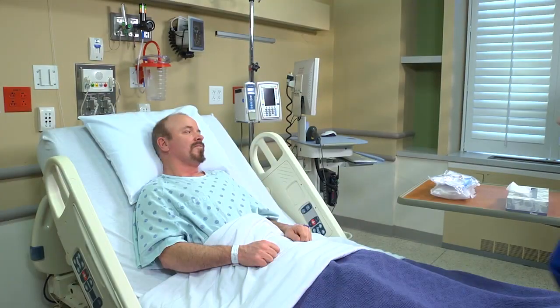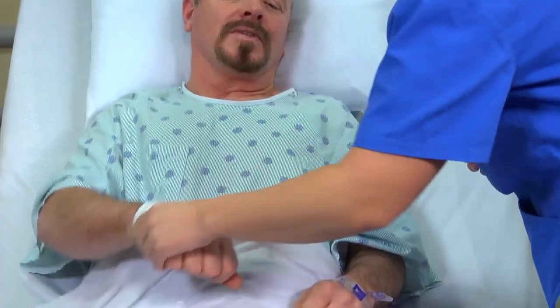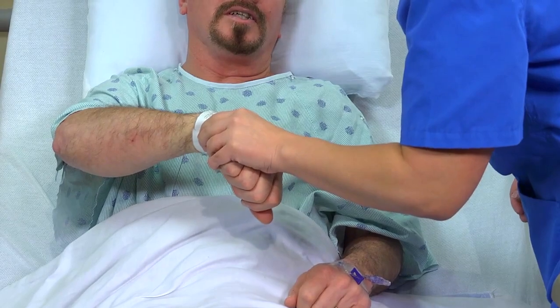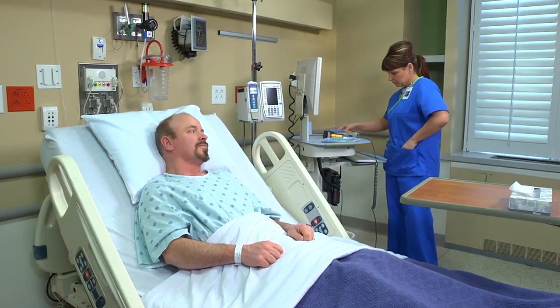Then identify him using 2 identifiers. Can you tell me your full name and date of birth? Frank Ferguson, 11461. Okay, great. Now you're ready to calculate the flow rate.